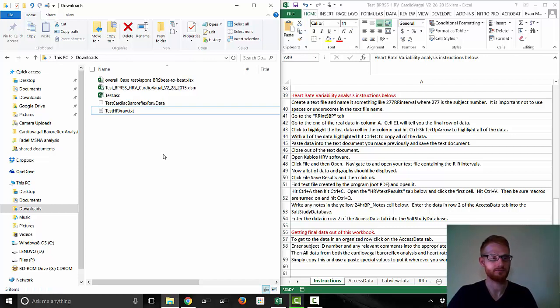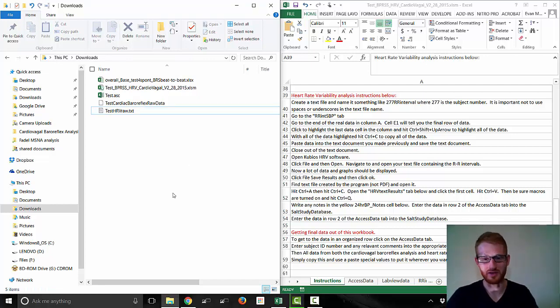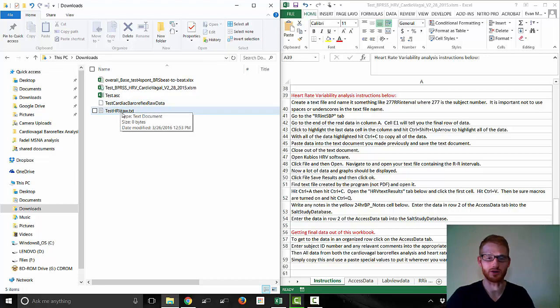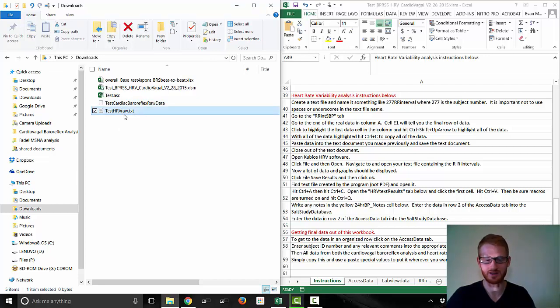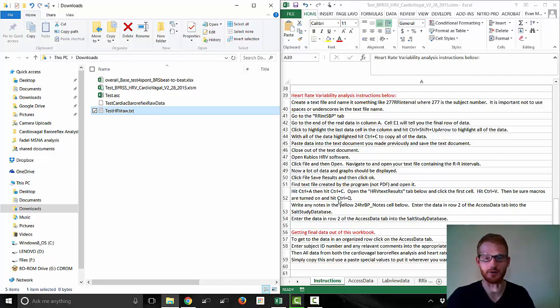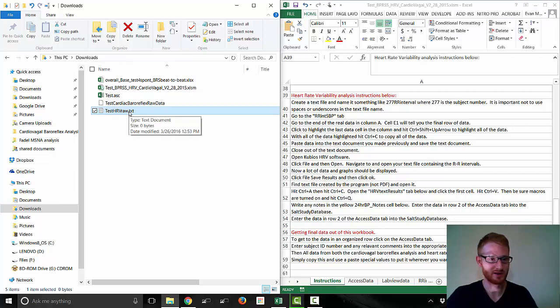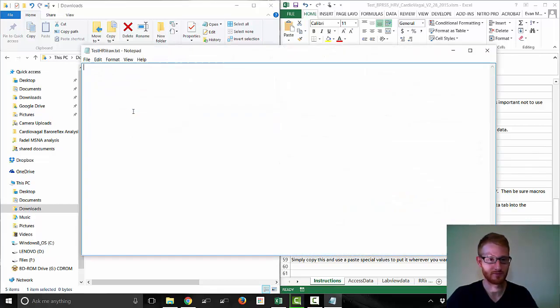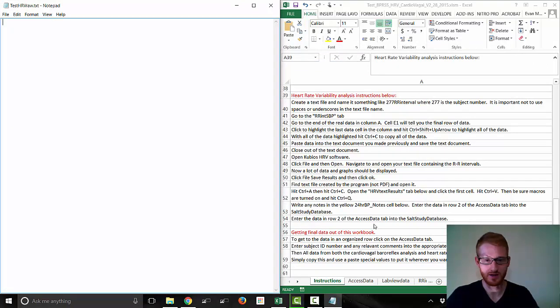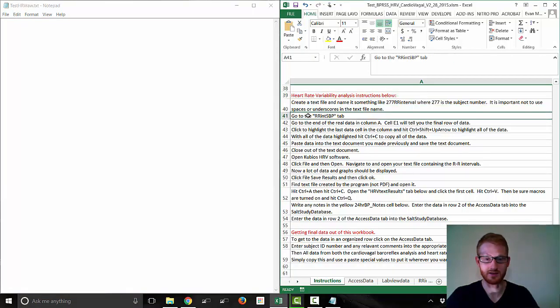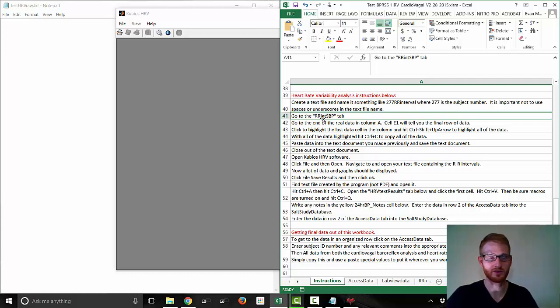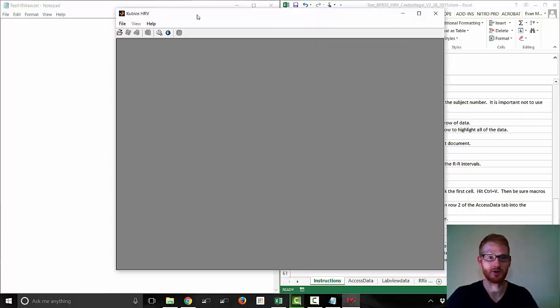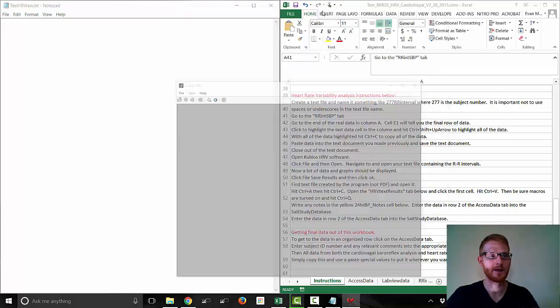It's important that you don't put spaces or underscores in this file name, because the Kubios software won't be able to analyze it, it won't be able to load it. So we're going to open up this file, and it's just a blank file, and we need to input it. The instructions are telling us to go to the RR interval systolic blood pressure tab. Here's the software, it finally opens, I'm going to minimize it now.